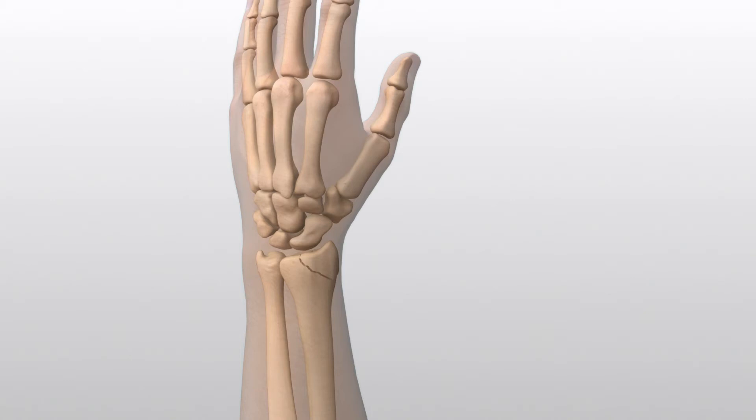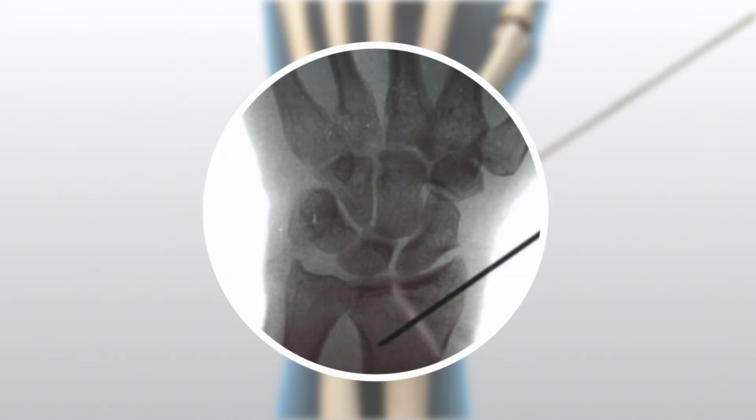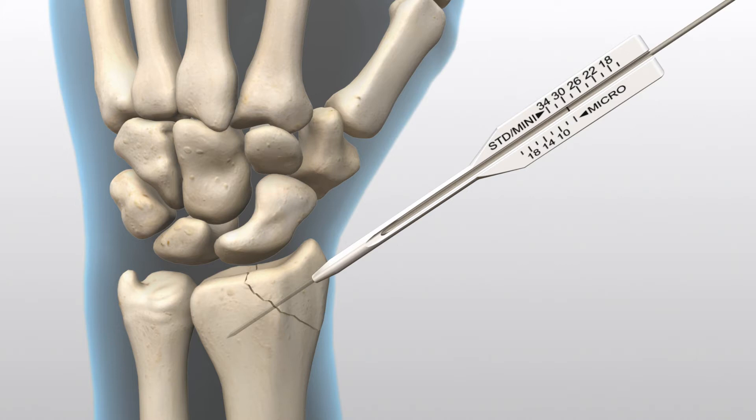Radial Styloid Fracture. Reduce the fracture and secure it using a 0.054-inch guide wire at the desired screw placement location, at least 4 to 5 millimeters past the fracture site. Confirm wire placement and depth under imaging. A 0.054-inch parallel wire guide is available and may be used to assist with a second wire placement and help maintain reduction and rotational stability.